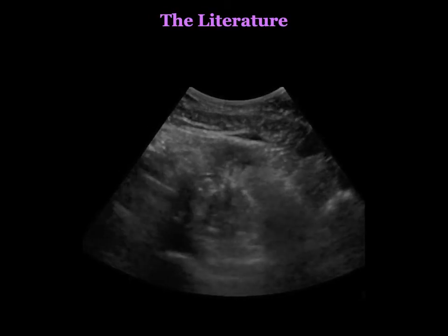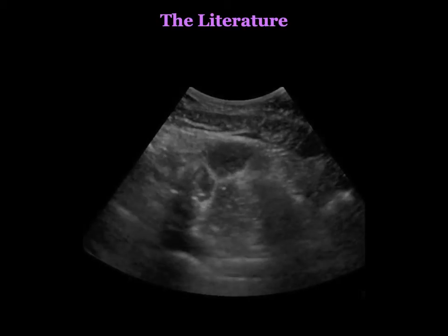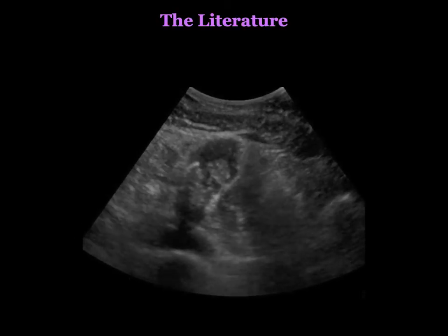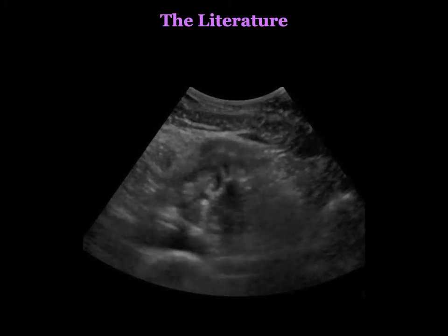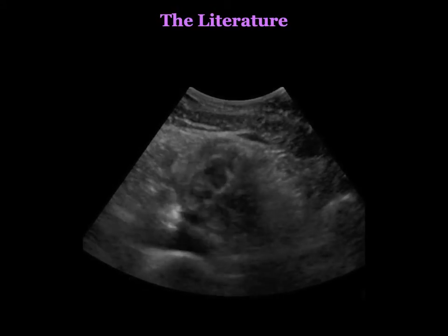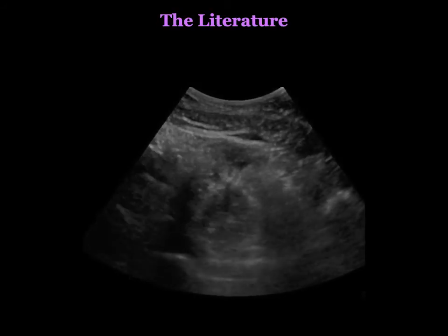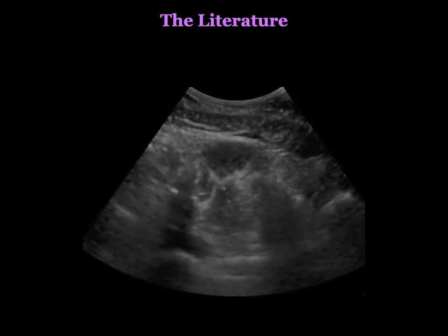In Europe, specifically, ultrasound is performed much more frequently than in America, not only to limit healthcare costs, but also to limit radiation. Most hospital wards have an ultrasound machine on every floor, which the residents and the attending physicians can use. And there are far fewer CT scanners in the hospitals across Europe.